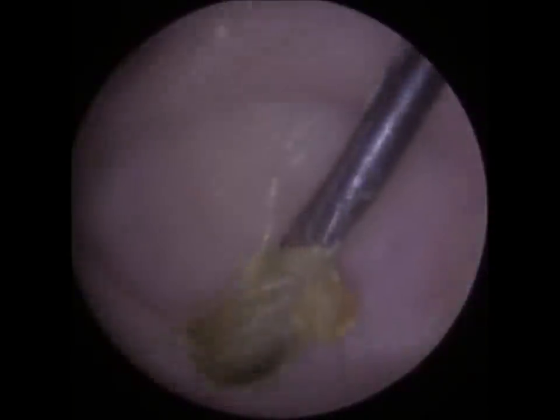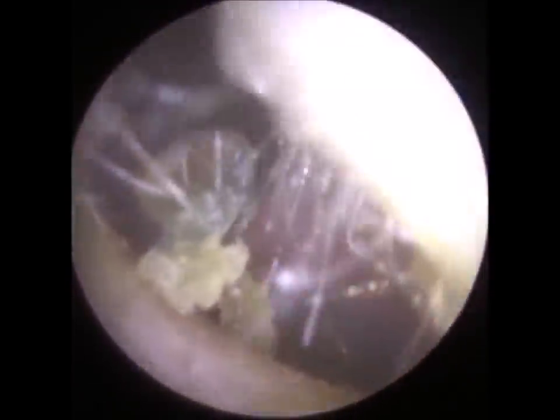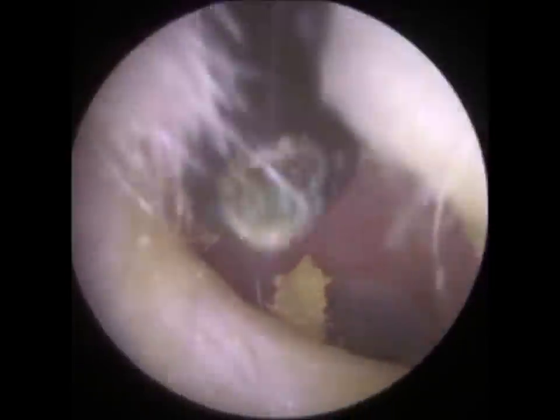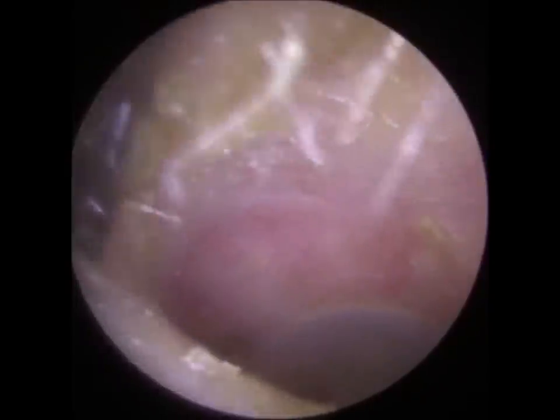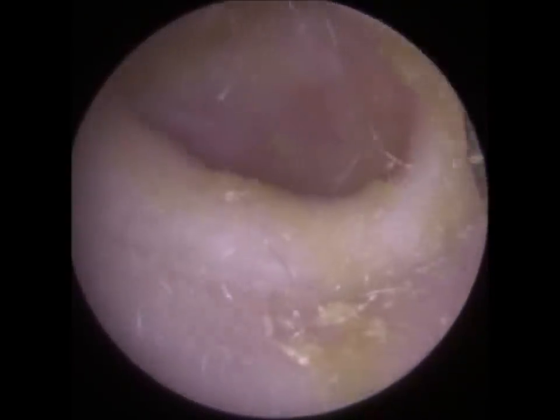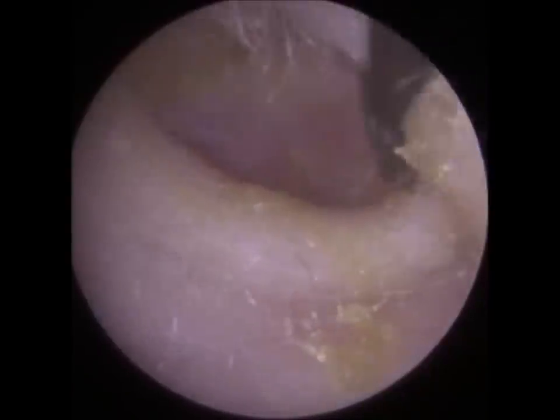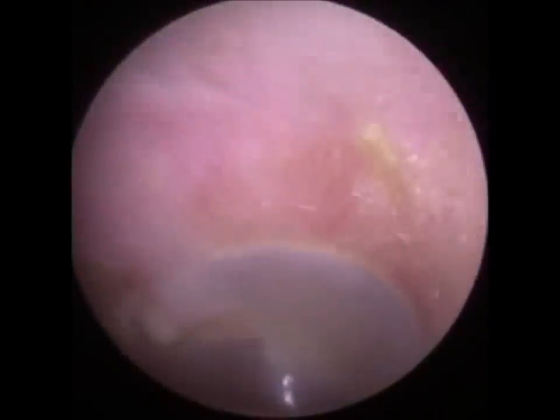It's very difficult to vacuum this type of wax because it's sticky and it blocks the tube. It's got some brownie edge. That's all done.